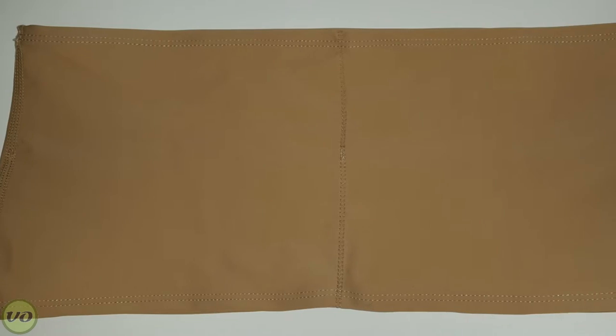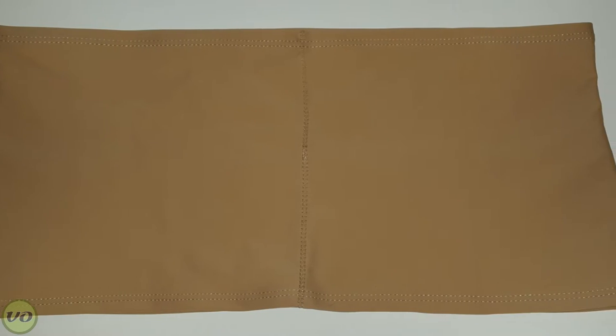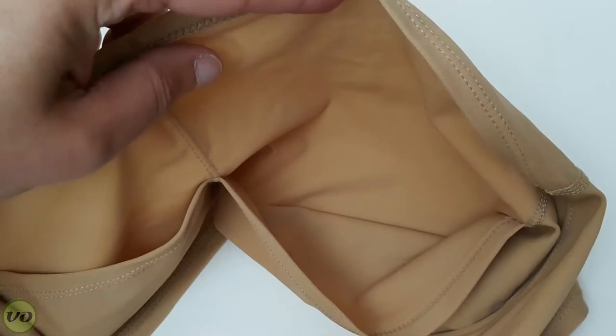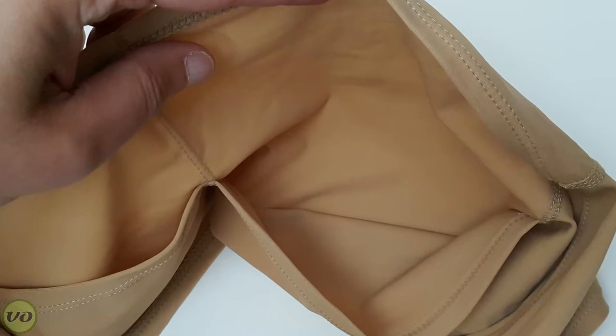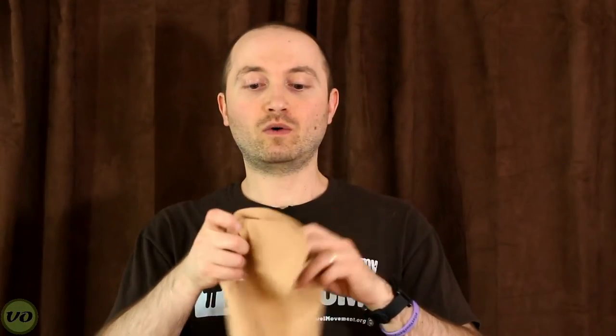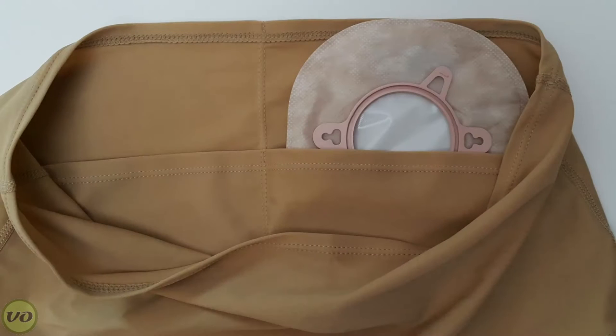The first product I want to introduce is the swim band. Now if you're familiar with regular ostomy wraps, especially the ones from Ostomy Secrets, you'll be pretty familiar with how this particular band works. As you can see, there are two pockets on the inside, and these pockets are made to accommodate your pouch. There's a left and a right side to accommodate both colostomates and ileostomates, and also people that might have a mucous fistula and an ileostomy.